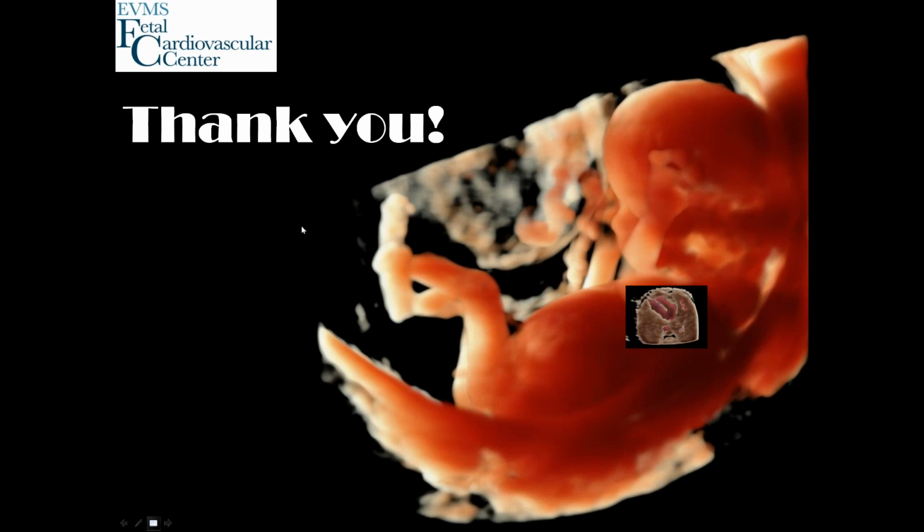But the cardiac axis itself is like a marker. The presence of an abnormal cardiac axis would be considered a positive screening test. Then you need to run the diagnostic test, which is the fetal echocardiogram, to get more details and put together the final diagnosis. It is typical to have left or right deviation for specific anomalies, but the deviation of the axis alone is not going to help you with the final diagnosis, because you need to look at different views and see more details about the heart in general. And usually that requires consultation with specialists in pediatric cardiology.